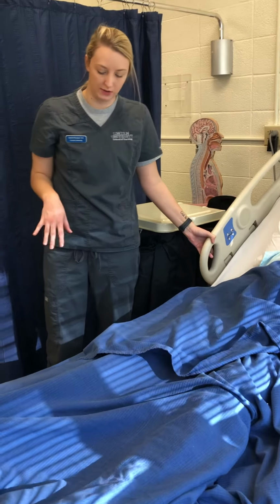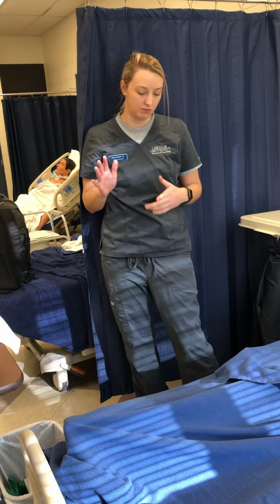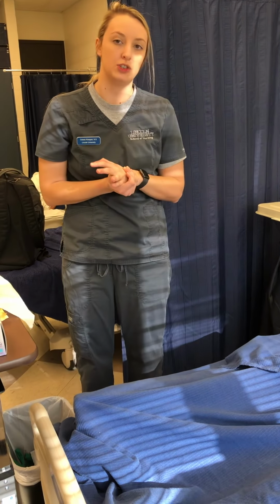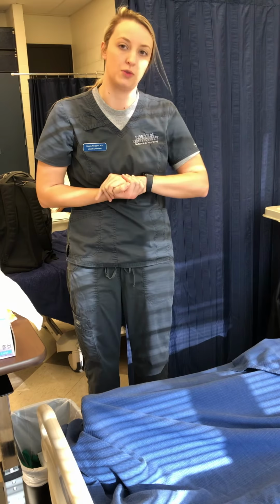And then I would document everything I did. I would document how much urine came out, the color, odor, quantity, how the patient tolerated the procedure, and then I would wait until the order to remove it.